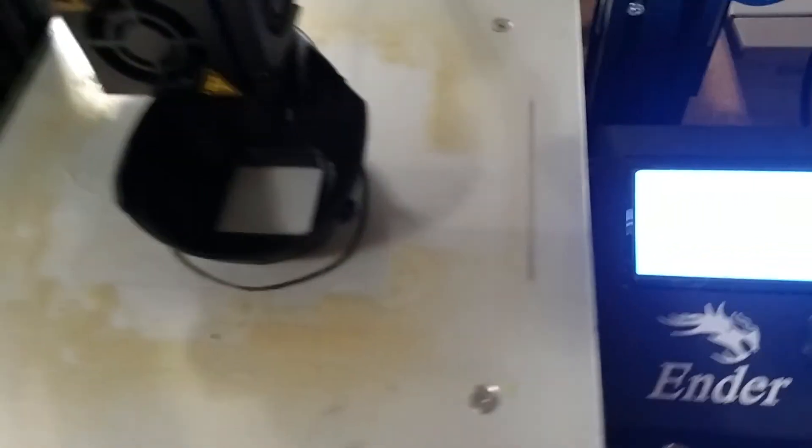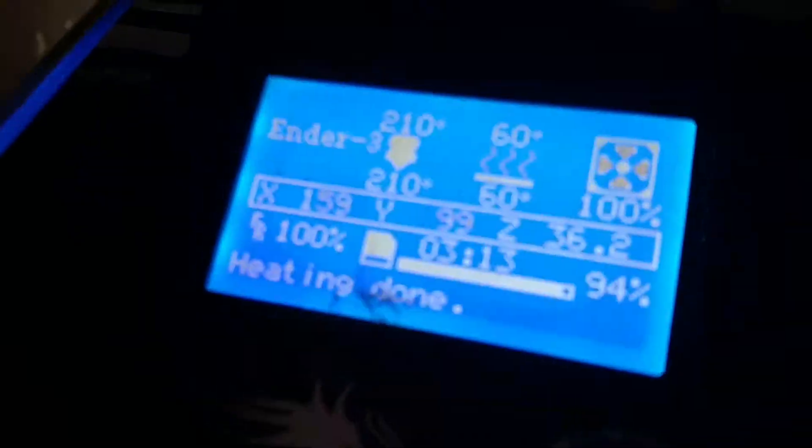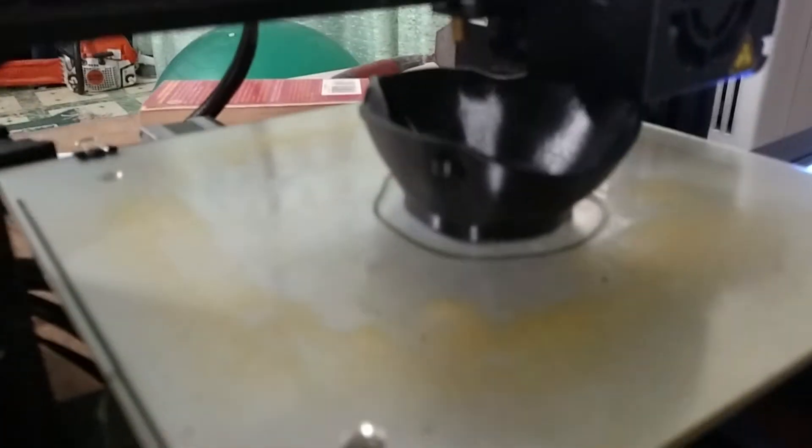Hey, it's Christian with Peregrina Solutions. We are at 94% complete on our first mask here. Again, to reiterate, this is the small size.